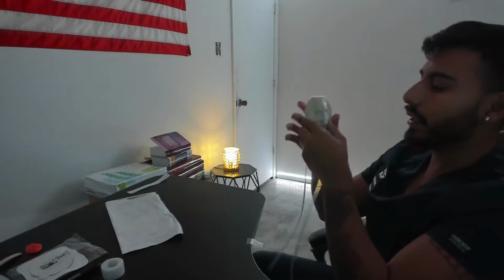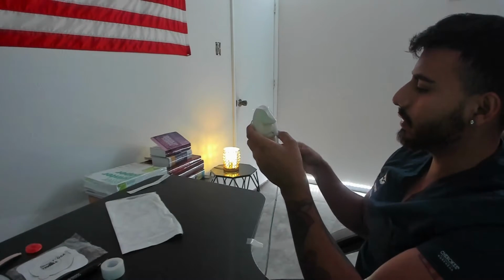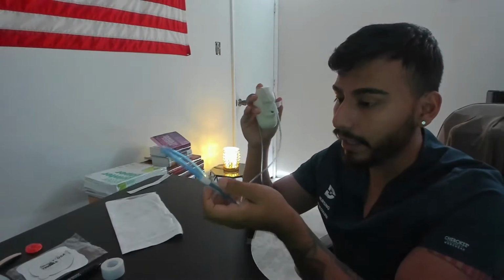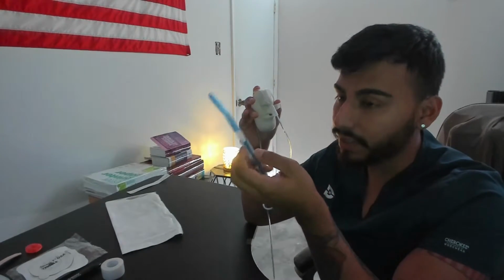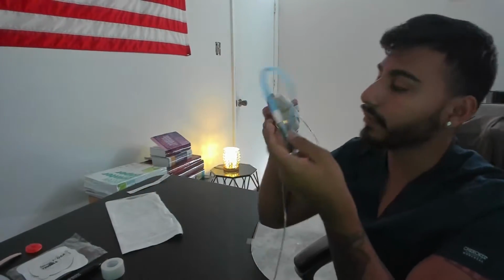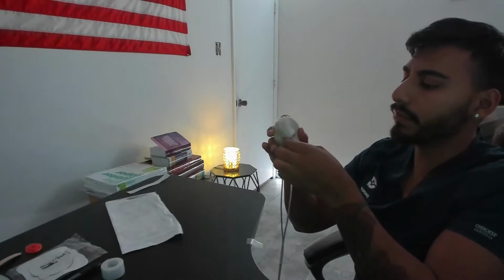So what I want to do next is attach my tube, but before I do this, I want to note that my NG tube was already clamped. When you take it out of the bag, you want to clamp it, because if you stick that tube in and it's not clamped, all the juices might come out. So you want to keep it clamped. Mine came clamped, that's why I didn't mention it, but I do want to verbalize that.